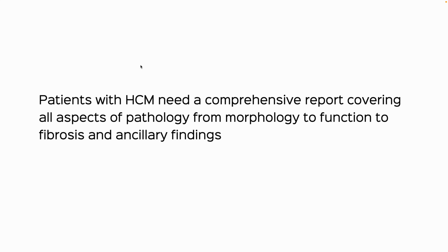So patients with hypertrophic cardiomyopathy need a comprehensive report covering all aspects of pathology from morphology to function to fibrosis, and a mention of any other ancillary finding that might be there.